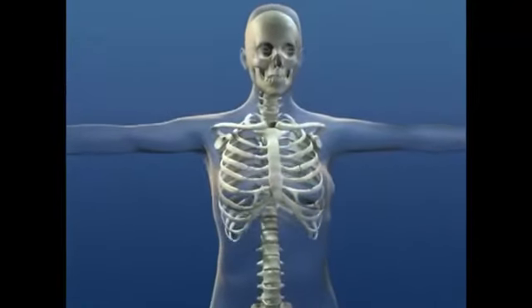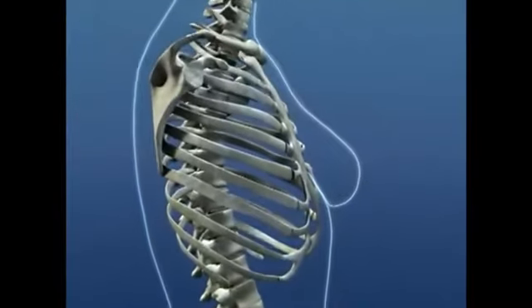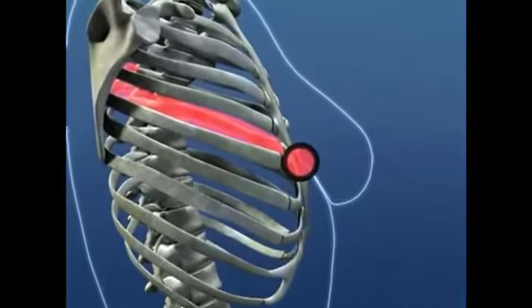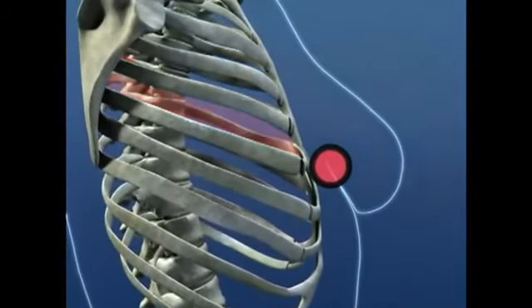In females, always be aware that the nipple may be displaced inferiorly due to large pendulous breasts. In this case, remember to stay above the inferior mammary fold where the nipple would normally lie.